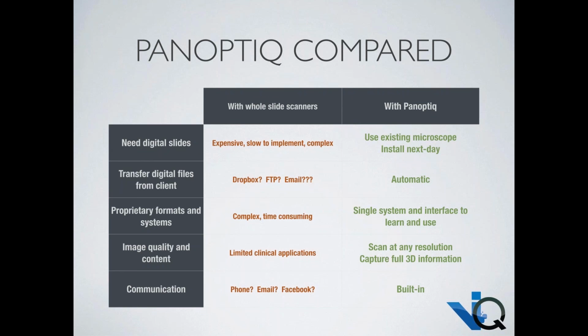I'm just looking at a couple of questions. There was one question about how long it takes to scan a slide today. Typically, it would take you 1, 2, or 3 minutes or so to scan a slide, if you need regions of interest where you want to scan at a higher resolution, let's say some regions at 40 times, 60 times or higher.